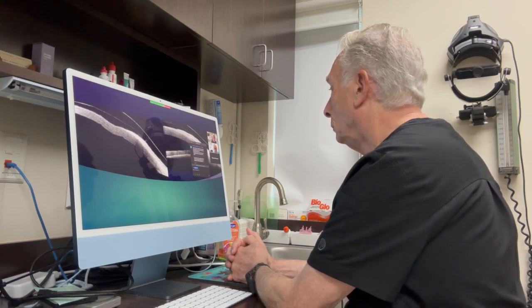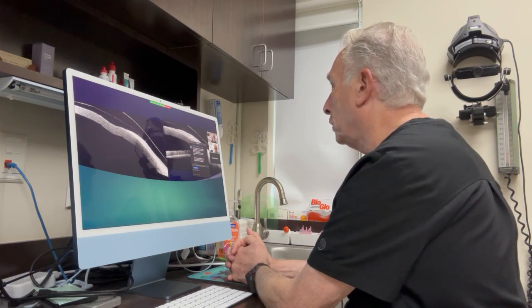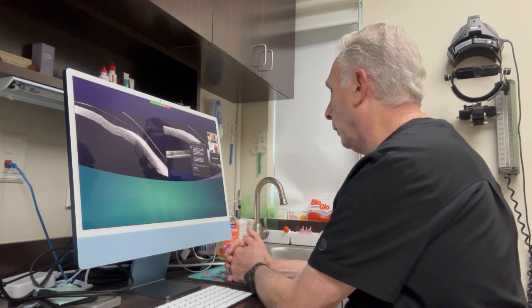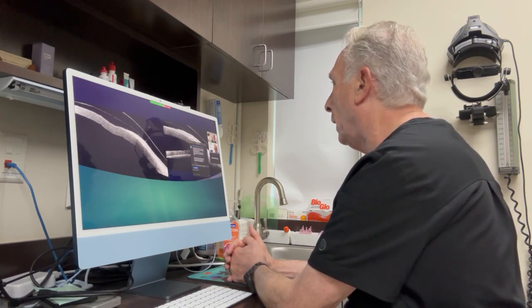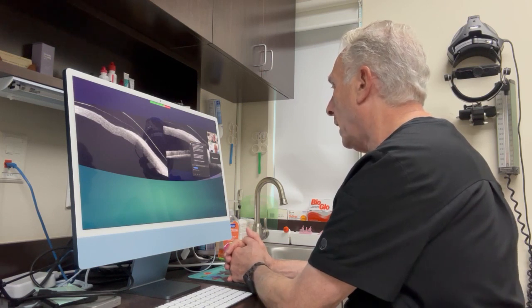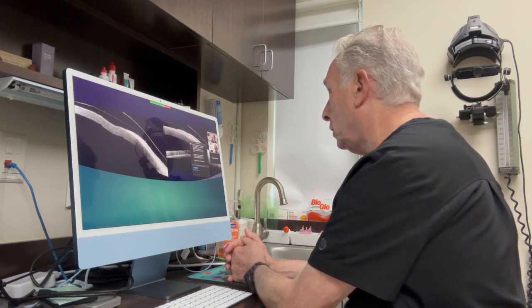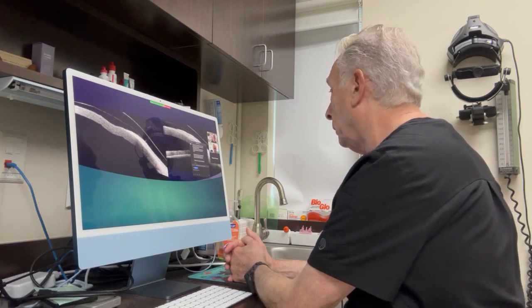So you think OCT would be the gold standard for sclerals in the future? Absolutely. There are several companies out there. There's a German company called Heidelberg that came out with a new anterior segment OCT called the Anterion, which they haven't really marketed, but that's available maybe in Europe. By Heidelberg, and I'm sure Zeiss and other companies will be coming out with anterior seg OCT.